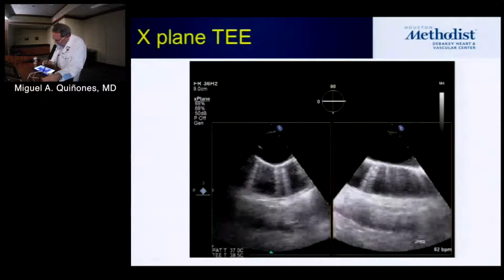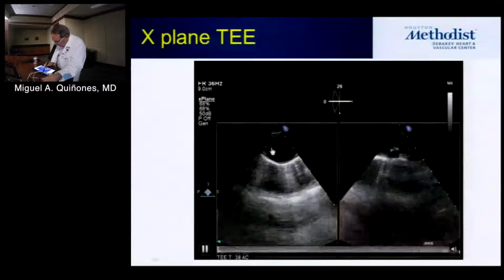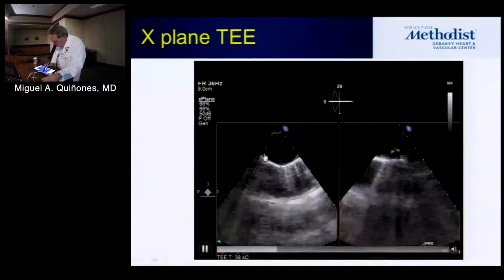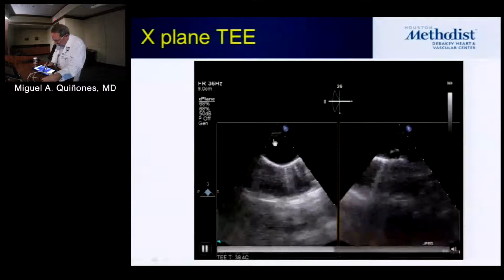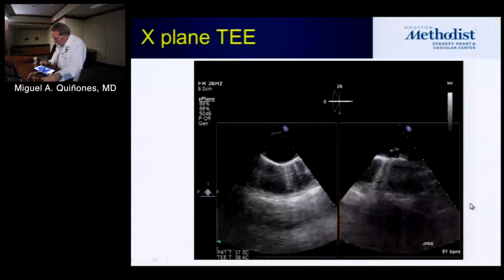So X-plane really has helped a lot, because when you put your line right where you are suspicious, you can see very nicely this raised grade 3 atheroma in a corner that, if we had done a traditional 90 degree, we might have missed. So this is one of the beauties of the X-plane, being able to shoot it right there and convert into the longitudinal plane and nicely see that plaque. That is pretty scary.